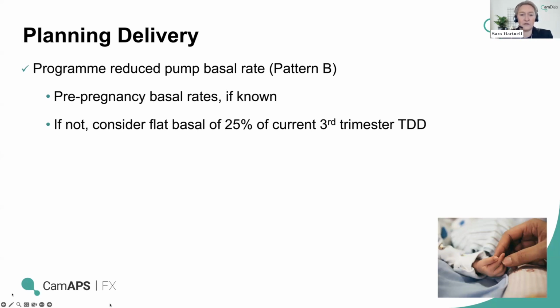They will have switched over to something. Again, hopefully not required, because in auto mode, the system will be doing its thing. But if the system came out of auto mode for whatever reason, there was a connectivity problem, whatever, it would go back to a pre-programmed pump basal rate at a lower, safer level for post-delivery.